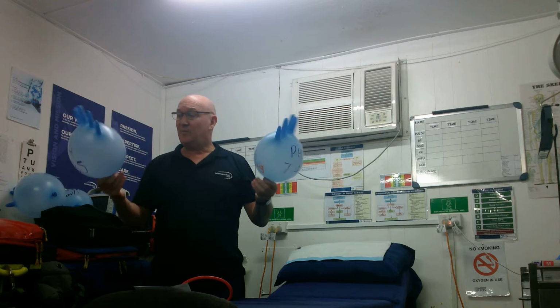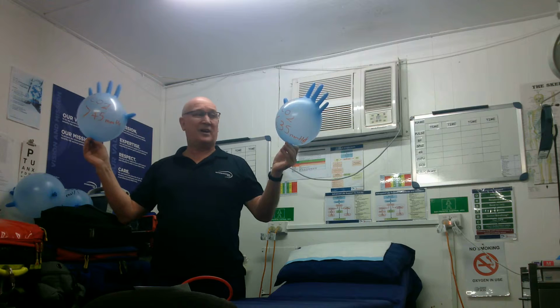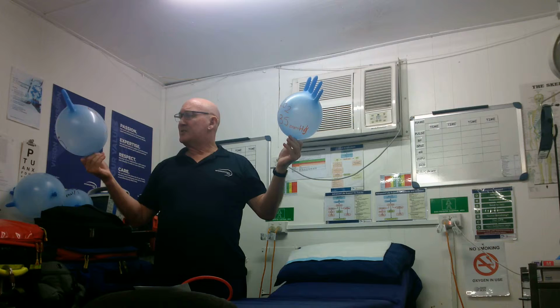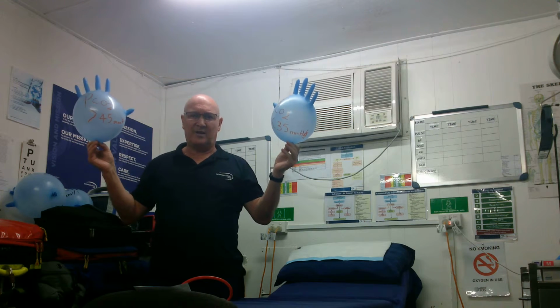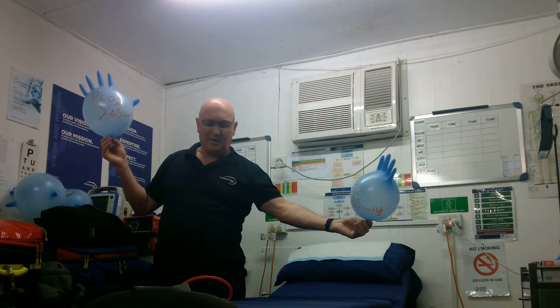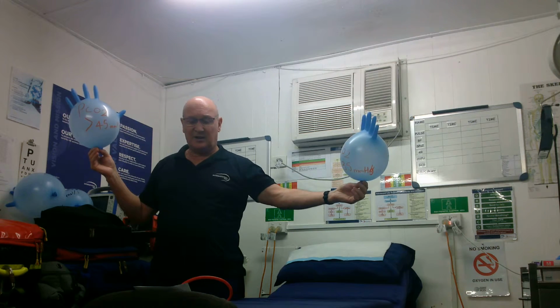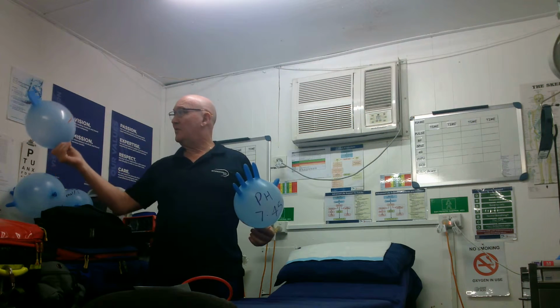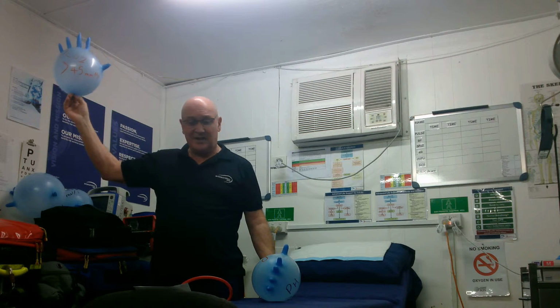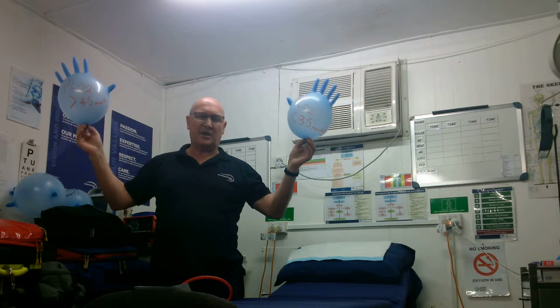Now, then we look at our PCO2. At the moment, 35 to 45 millimetres of Hg. So that's a normal range that we look at for arterial blood gases. So obviously, if that drops down, then we're looking at a low PCO2, and if they're alkaline, which could be respiratory alkalosis. So if the PCO2 goes up, and we already know the patient's acidotic, then that's respiratory acidosis. So that kind of gives us a good idea of what's going on.